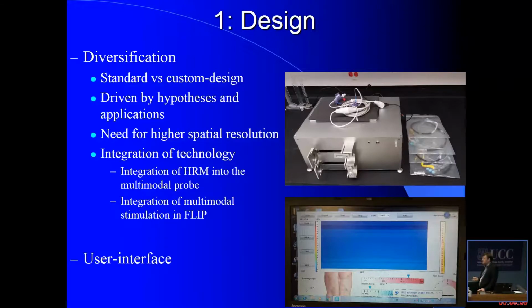I also think there might be some integration between the multimodal and EndoFLIP. I can certainly see how acid injection or sensitizing the tissue could be very useful in future FLIP studies. So that was the design.